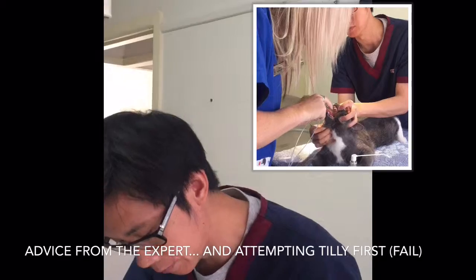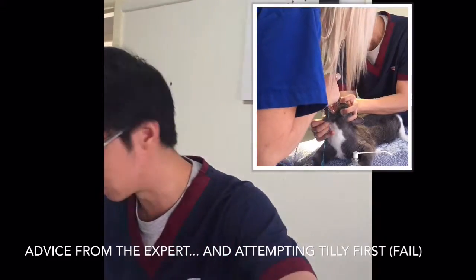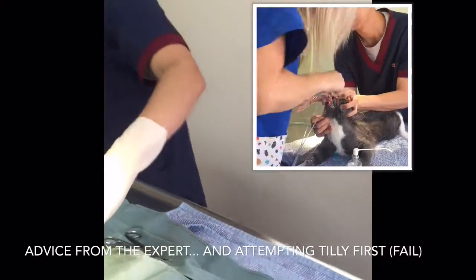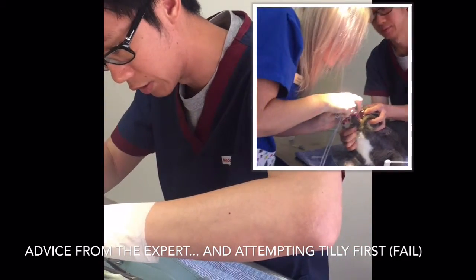Above you'll see my first attempt to tube Tilly. I was unsuccessful in finding the larynx, so I had to get the vet to take over. That was a great opportunity for me to have him demonstrate and explain how to insert the tube. This is observational learning and demonstrated through scaffolding.